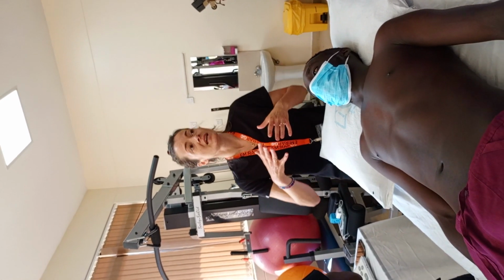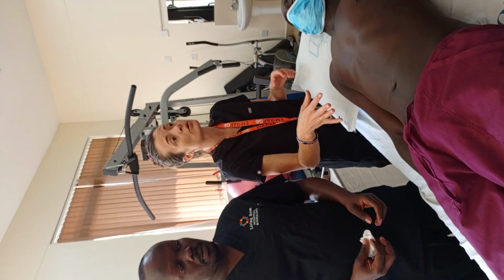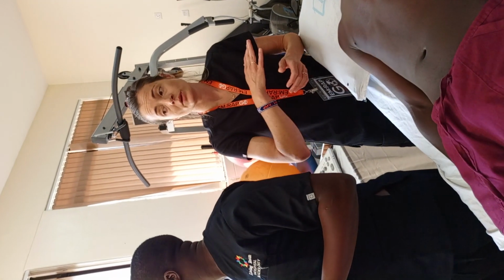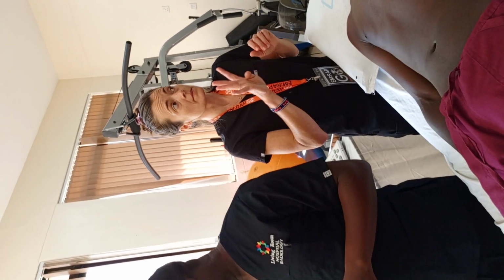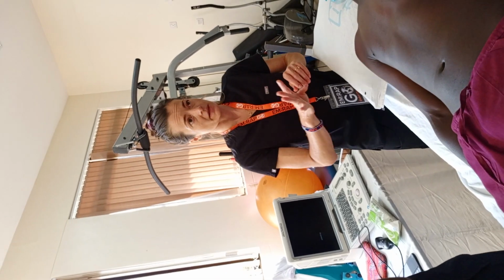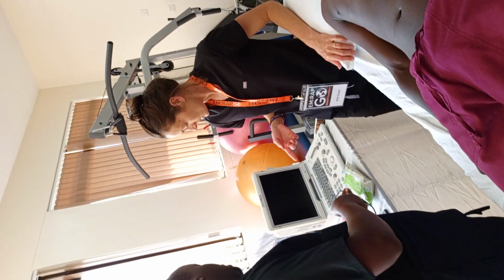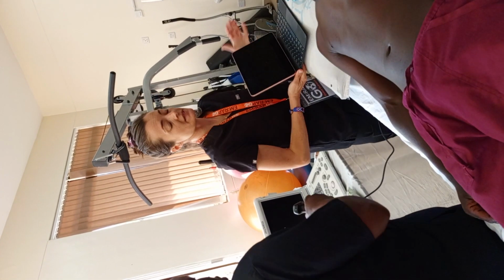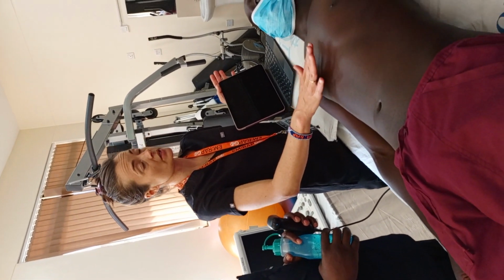So this is just to get you guys a quick introduction to ultrasound, and specifically we're going to look at the FAST exam. The FAST exam is what we do on pretty much every trauma patient. There's 4 main places that we're looking at just the basic FAST exam. That's going to be the right upper quadrant. Can you demonstrate? Cool. So the 4 places are the right upper quadrant, subxiphoid to look at the heart.